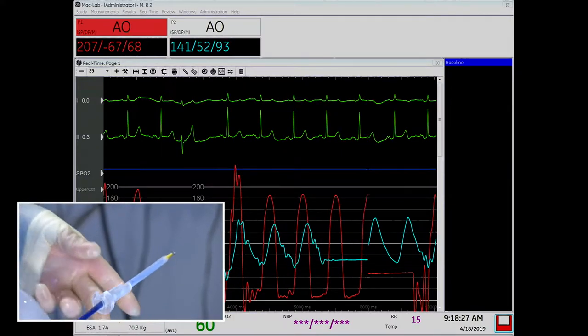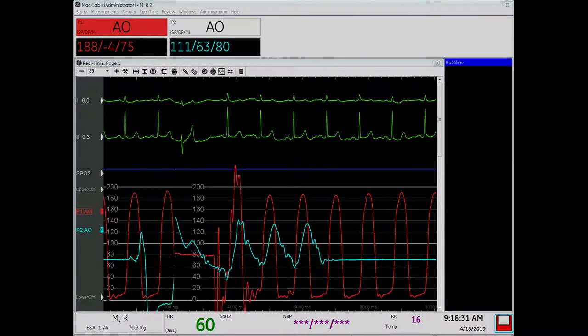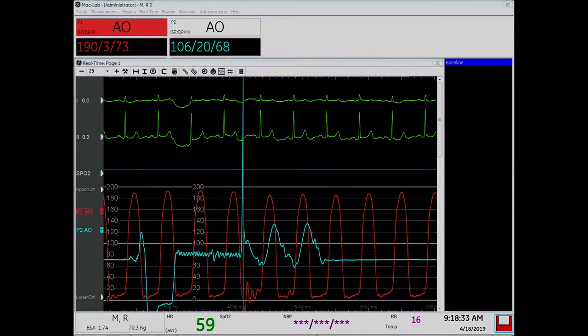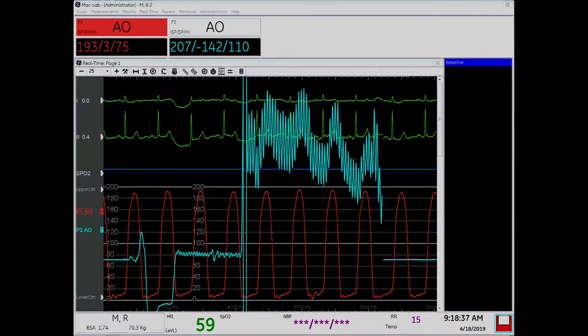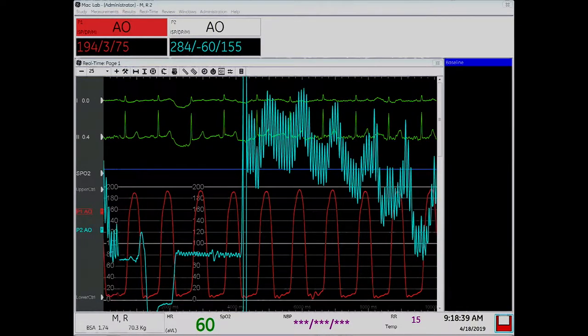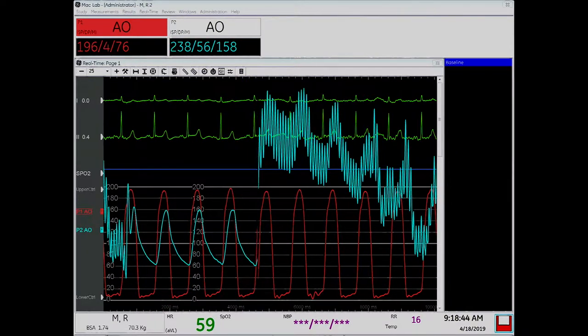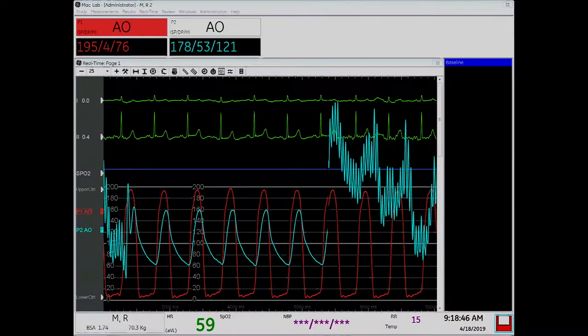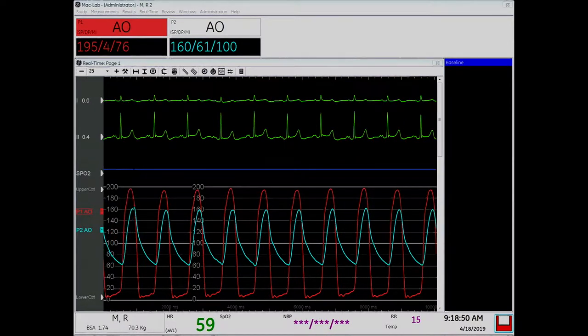So you can see the red and the blue, the difference there. The blue is flatline now because we're flushing it. The contrast makes the pressure measurements a little bit awkward. Let me just pull negative here. Okay, enough of that. What you see there is a gradient: the blue line's going up to 160, the other one goes up to closer to 200, so that's a 40 millimeter gradient.